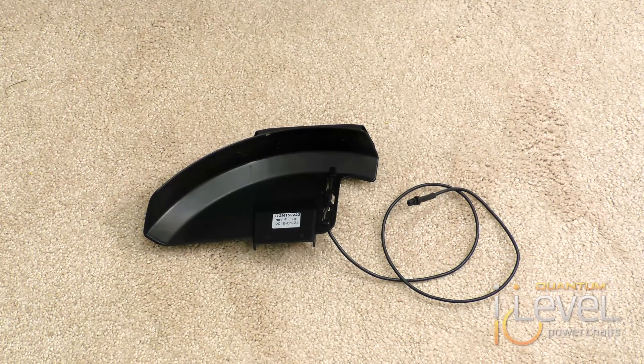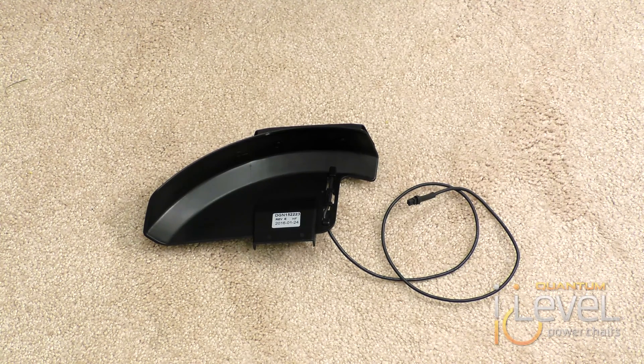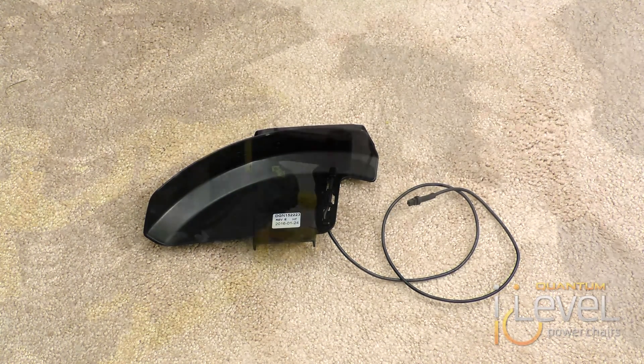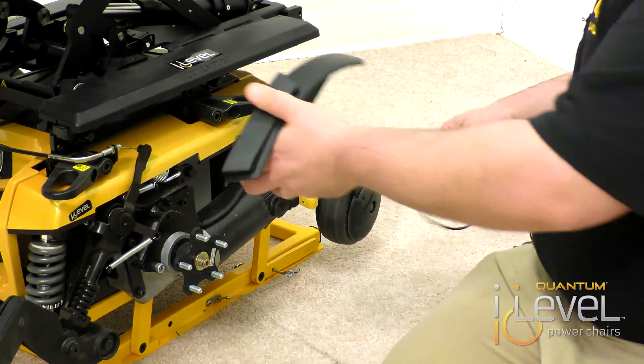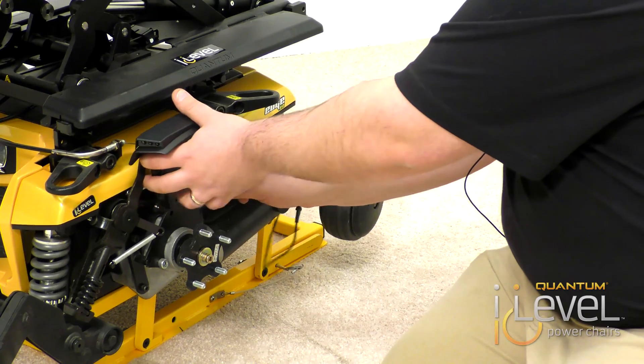Once your fender is removed, you will need your new fender light. The difference with the fender light is that there's a wire coming off of it, but you actually have the fender light molded right onto the fender. You want to make sure your wire is routed behind and doesn't get caught in any suspension.